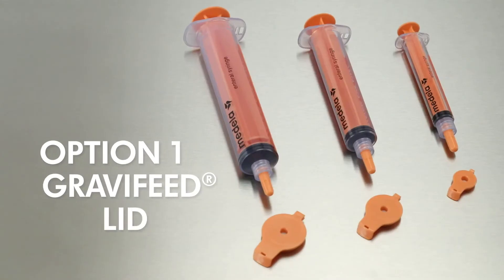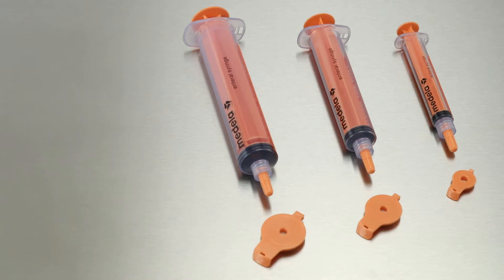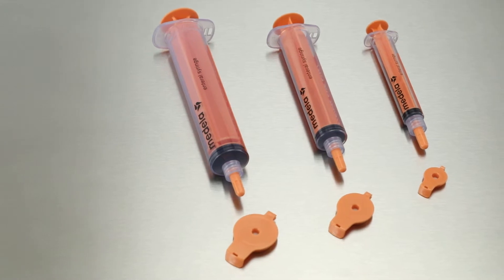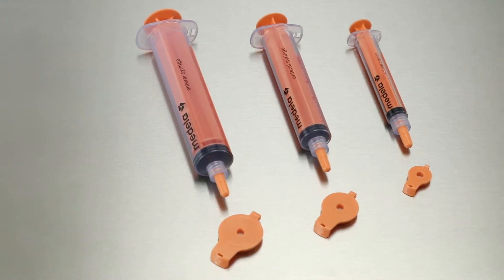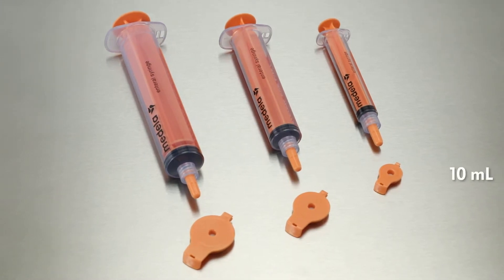Option 1. Gravifeed lids can be purchased individually and are packaged sterile. These can be used with your existing Medela syringes. It is important to use the correct size cap for the syringe size being used: 10, 30, or 60 milliliters.